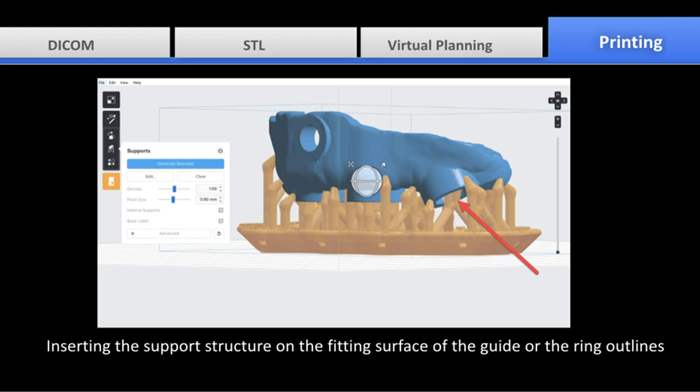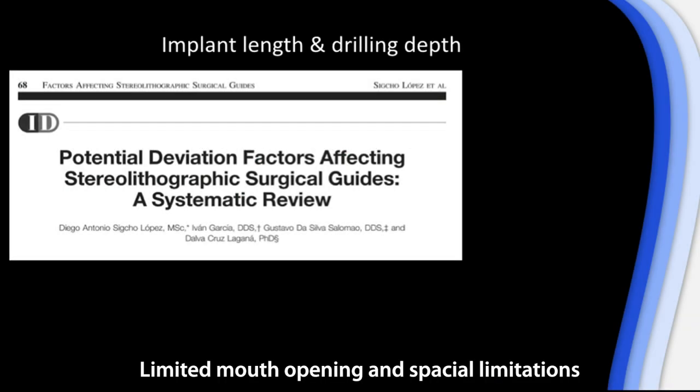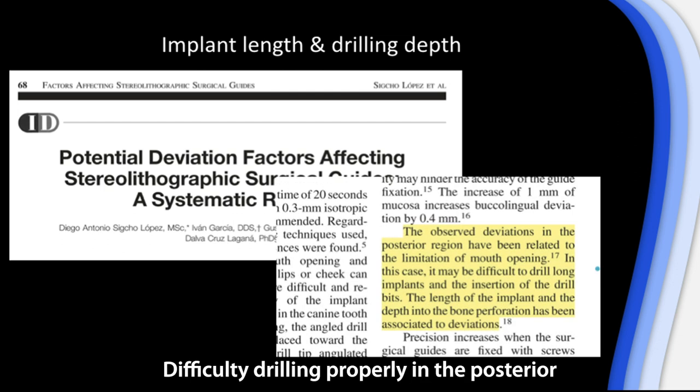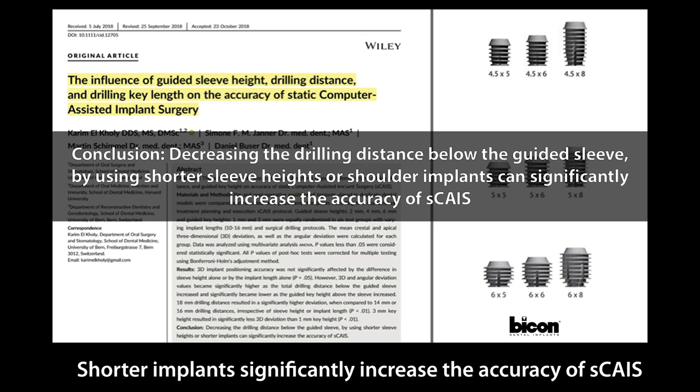Another potential source of error during printing is adding support on the fitting surface of the guide or the ring. Its removal later on might lead to a change in the internal dimensions of the guide, leading to a change in the angulation of the ring during placement. Other sources of errors could be the implant length, spatial limitations with limited mouth opening, and the inability of the operator to place the drill properly inside the ring, which might lead to deviations during the drilling procedures. It's also reported that the shorter the drilling length below the sleeve, the more accurate the final results, which supports the use of shorter implants with guided surgery.